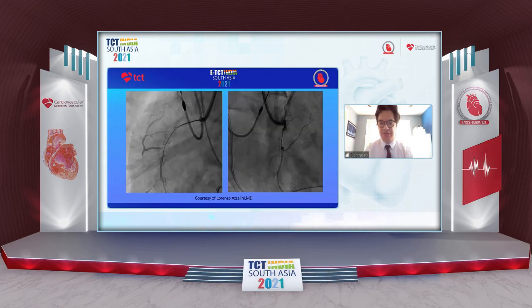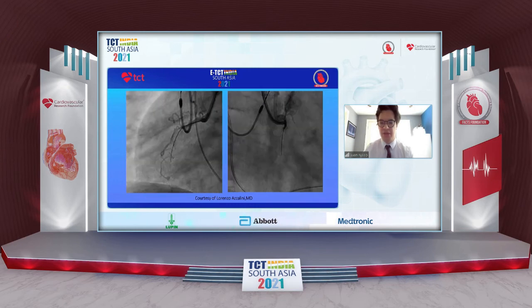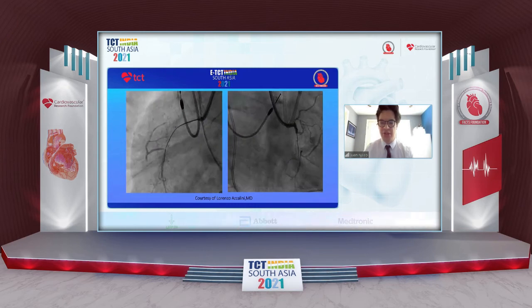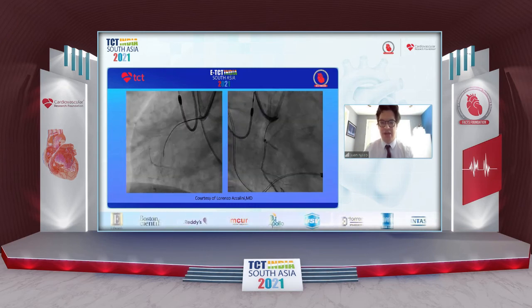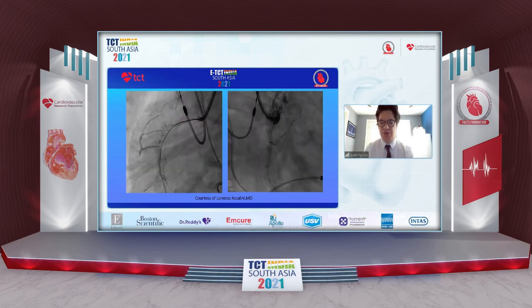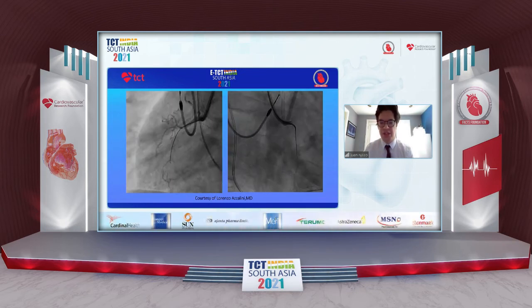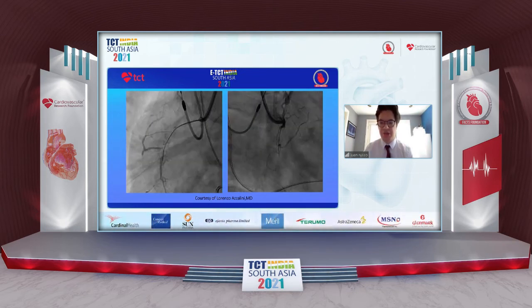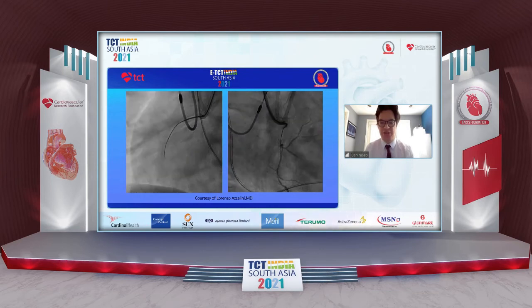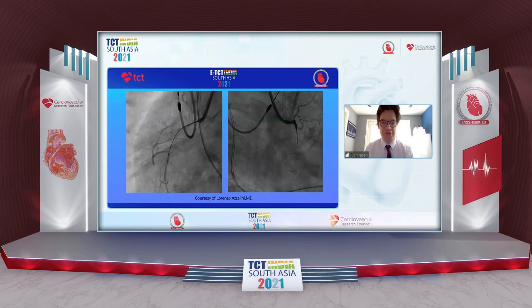And they were successful in getting to the distal cap, but the distal part of the wire was in the subintimal space. Now, in this situation, they would have to resort to dissection reentry or try to reattempt antegrade wire escalation or use parallel wiring. But in this situation, they decided to go for antegrade fenestration reentry.